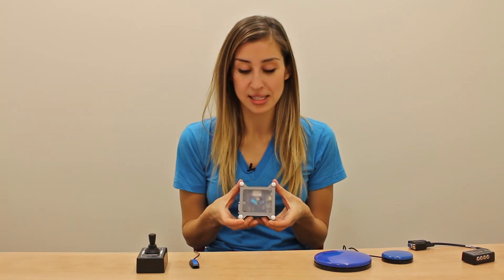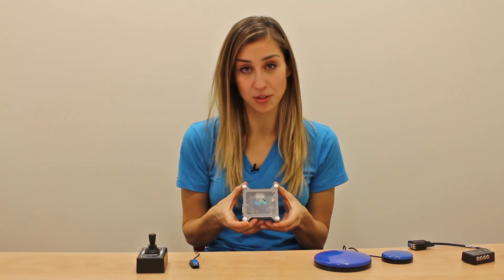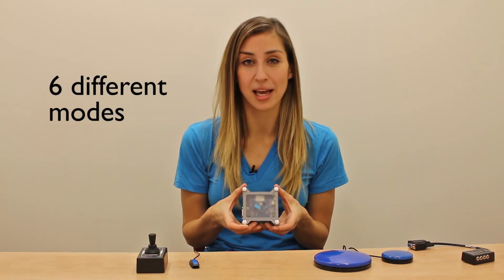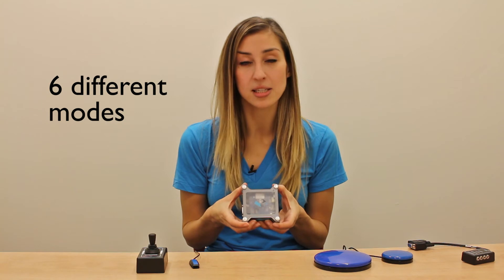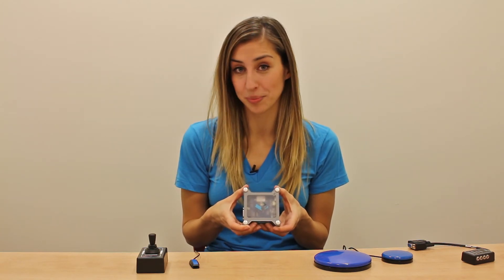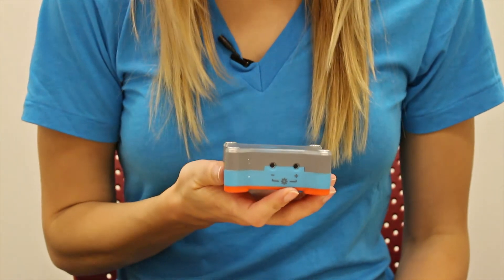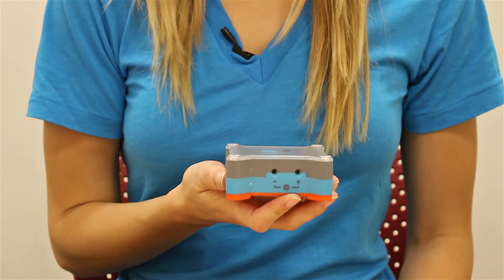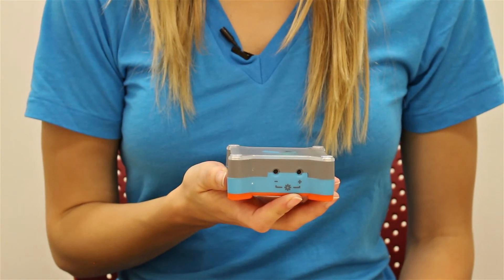Now that we've turned the Tecla Shield on, you'll notice a light glowing underneath the cover. This lets us know that we are connected to a device and which mode we're in, indicated by the color of the light. There are six different modes that the Tecla Shield can be in depending on whether we're connected to an iOS device, an Android device, or a computer. These modes can be changed with the buttons on the side here. In some modes, these buttons are also used to adjust settings like scanning speed.